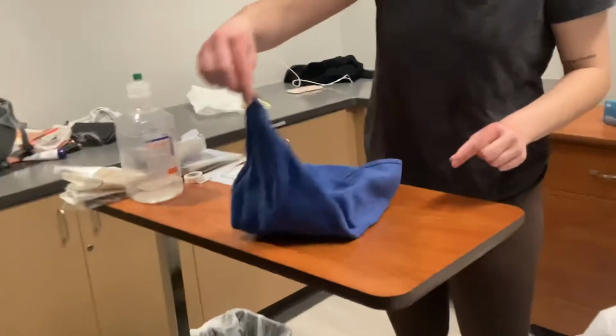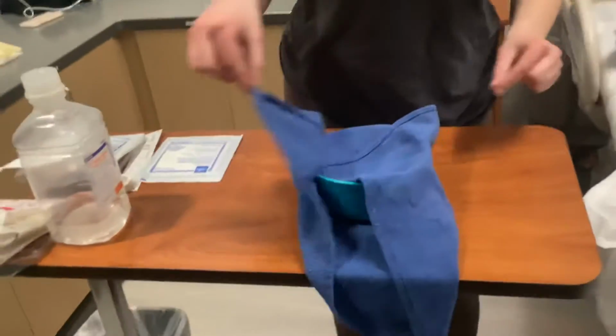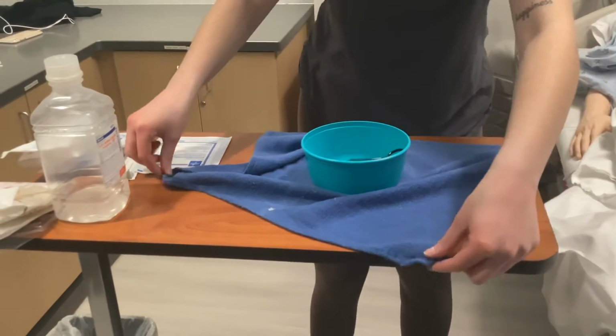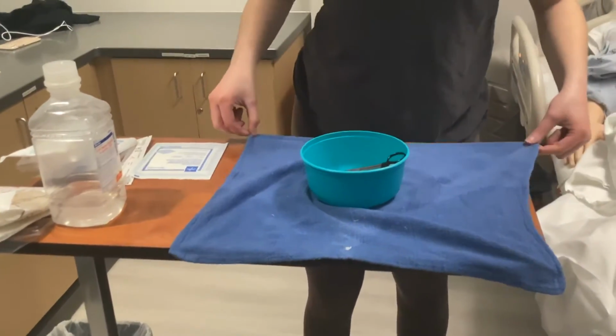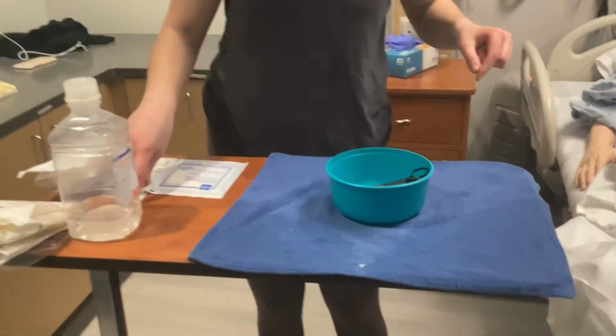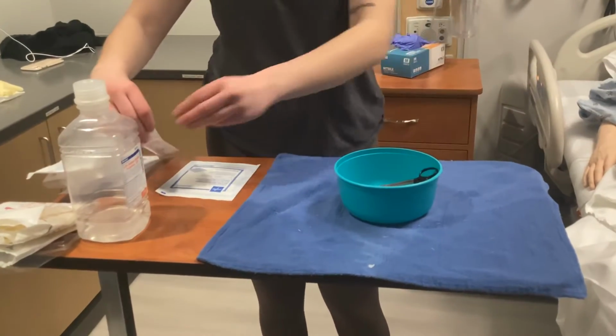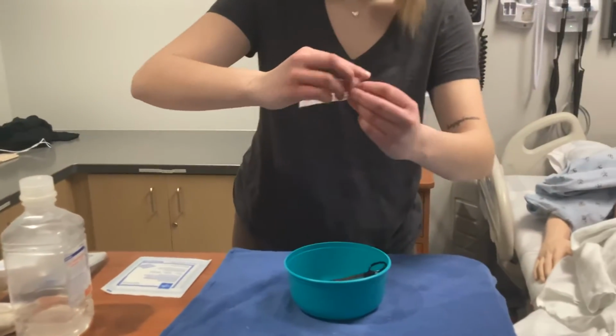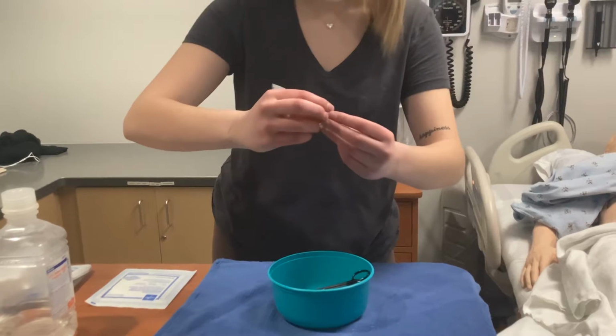And during this I have a 1-inch margin. All right, I'm going to peel each supply away from my body. Cotton. I'm going to put the cotton swabs in the bowl.